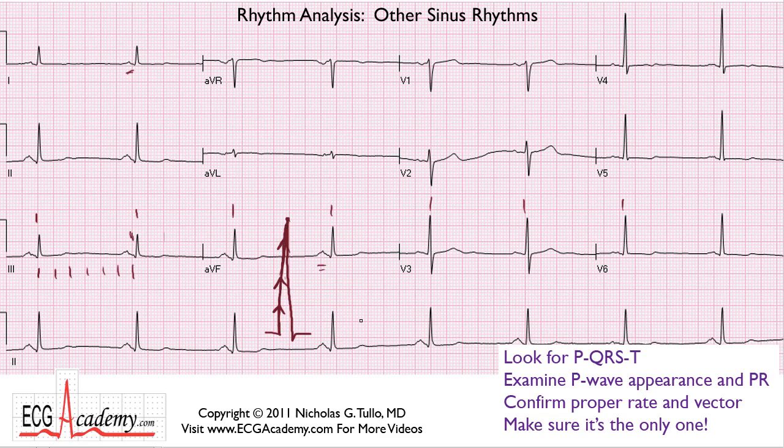If you look at sine waves, electronic waves of electrical energy, sine waves are measured in frequency. How often do these occur? And that's related to how far apart the waves are. T waves tend to be very low in frequency. In other words, they're very gradual changing in the voltage.